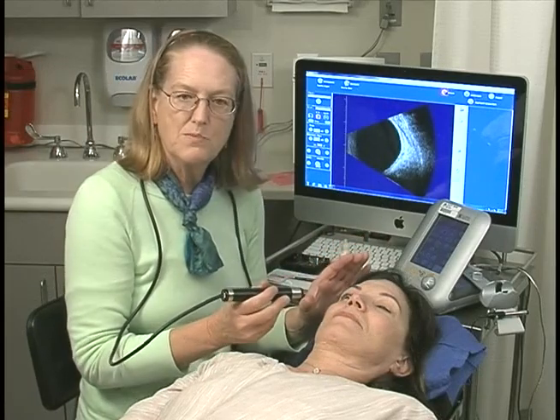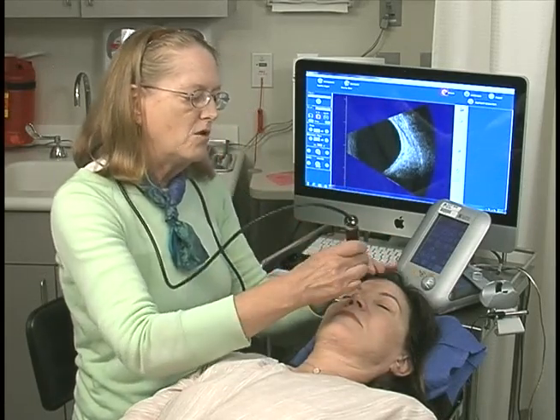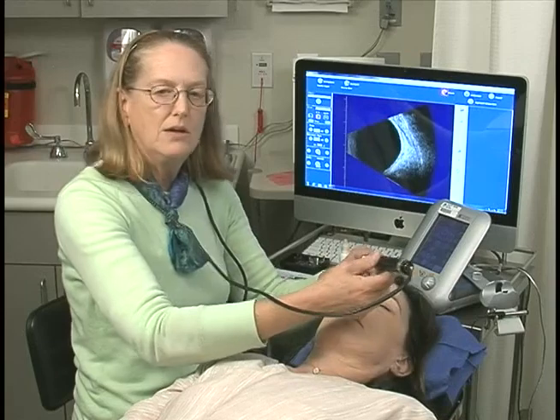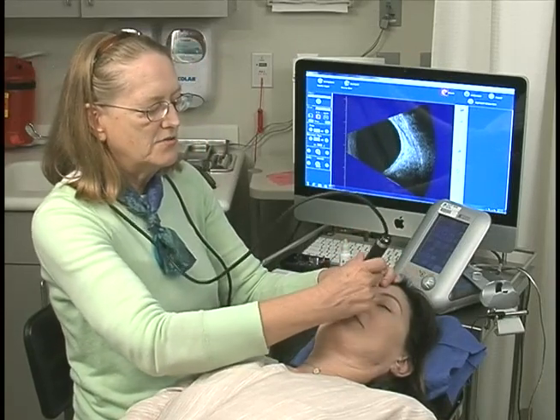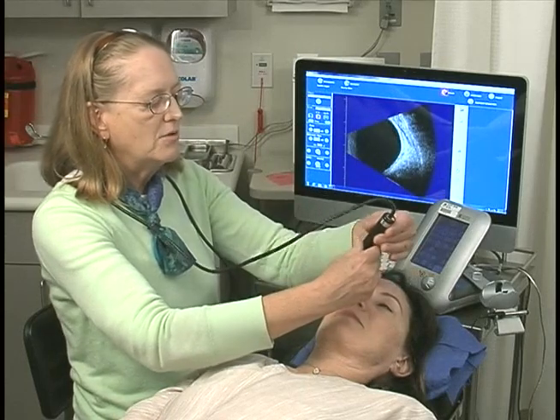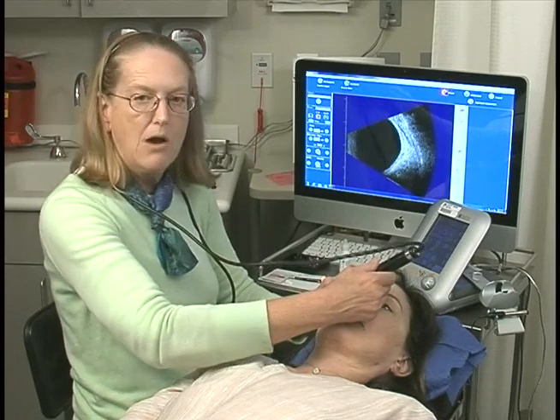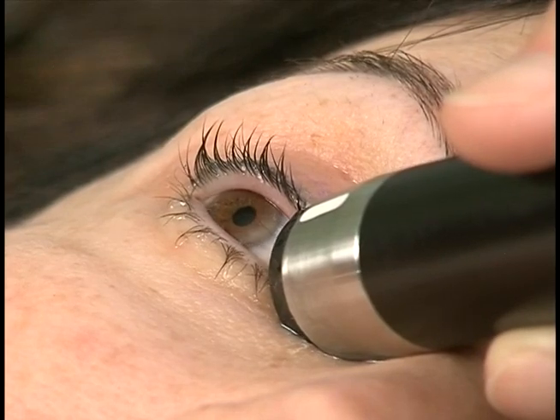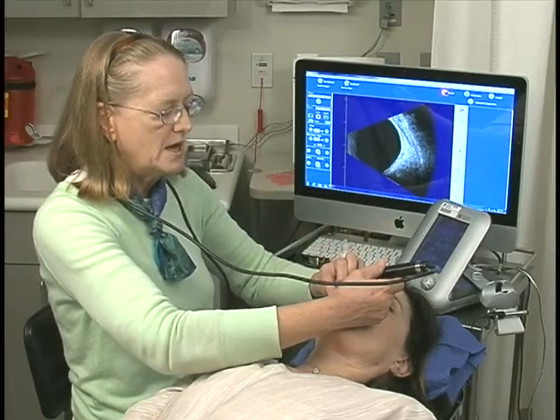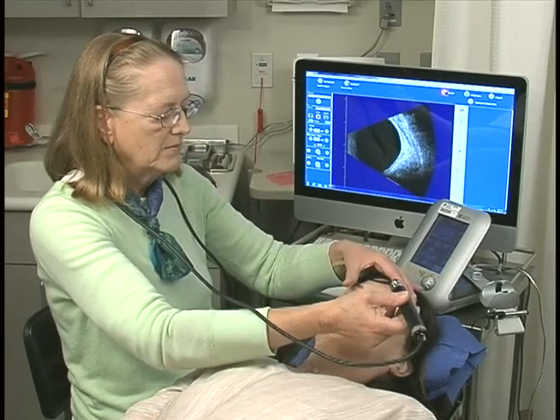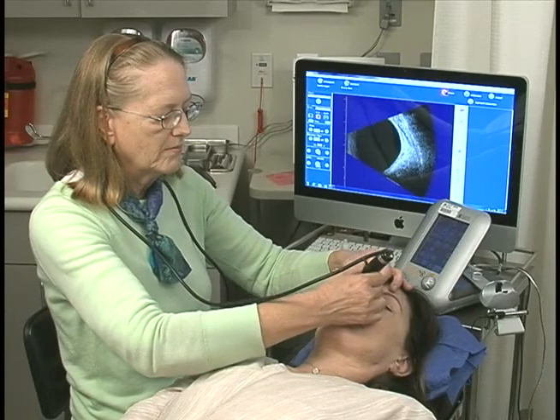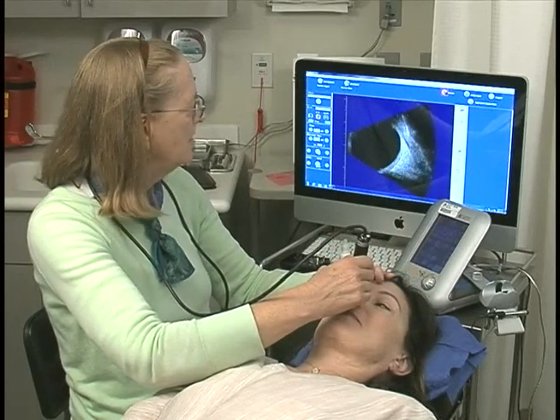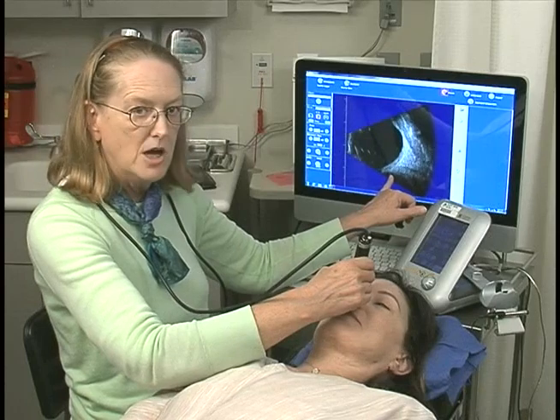So occasionally a transverse might be needed. However, I will normally go from my final transverse position of looking temporally immediately to the radial or longitudinal scans. When I had the marker superiorly, I am now going to place the marker pointing toward the clock hour I would like to image. I would like to image 9 o'clock on her right eye, which is the meridian where the macula lies. So the marker is pointing toward 9, the patient looks at 9, and I place the probe here in the fornix. I'll turn the gain down a little bit. What you see is the optic nerve at the bottom of every longitudinal scan.